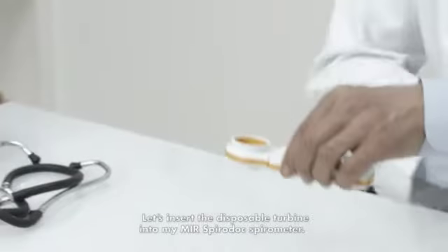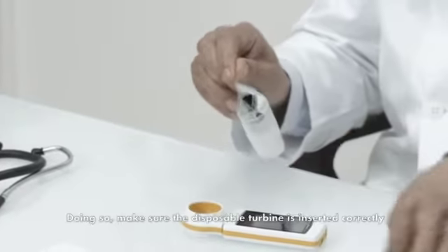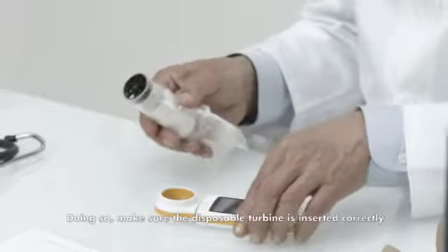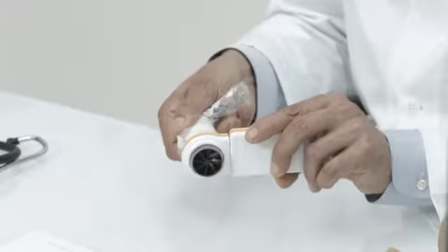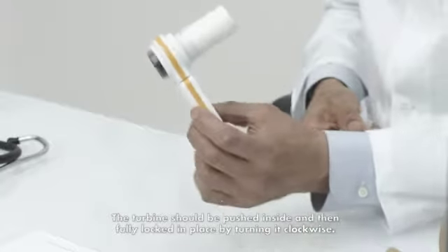Let's insert the disposable turbine into my MIR SpiroDoc Spirometer. Make sure the disposable turbine is inserted correctly — the locking arrow keys should be facing towards you. The turbine should be pushed inside and then fully locked in place by turning it clockwise.